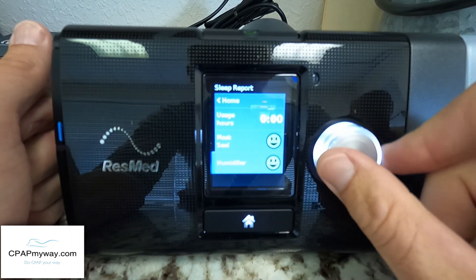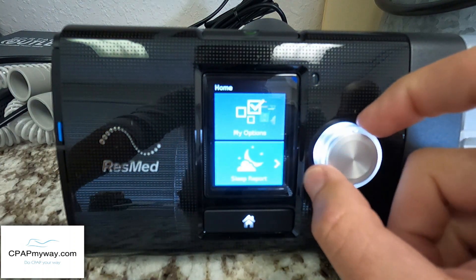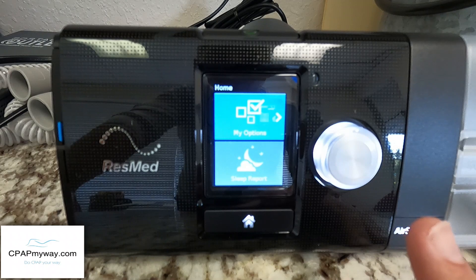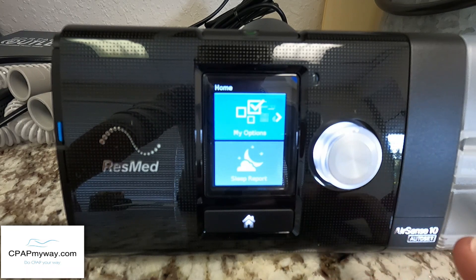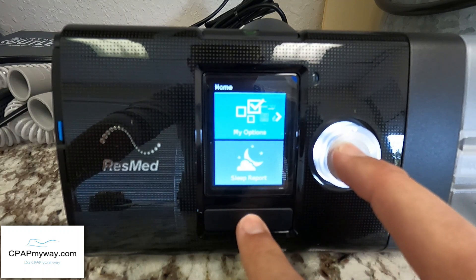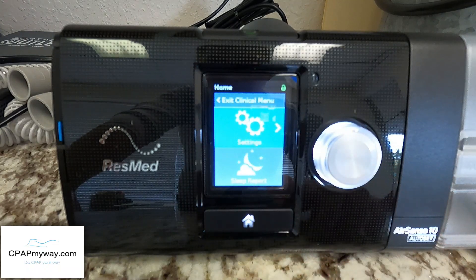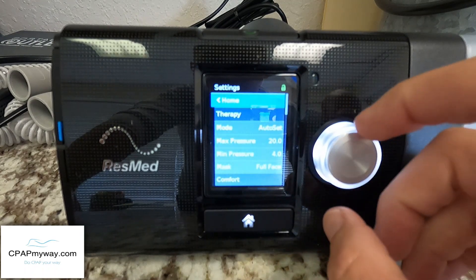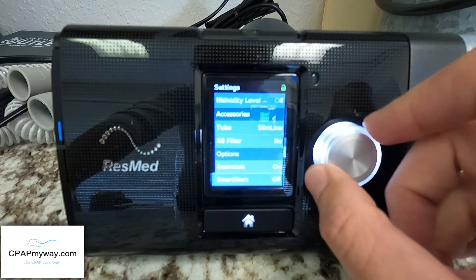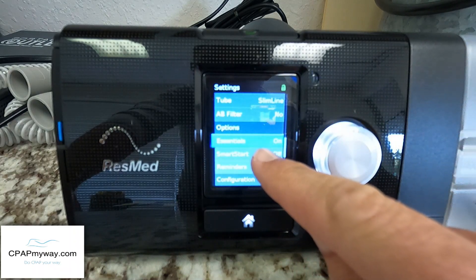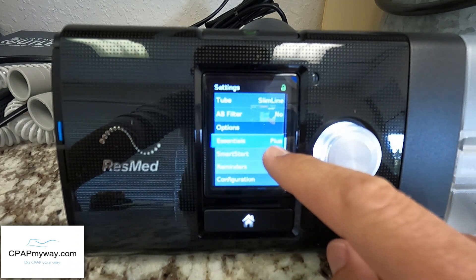On your device you have 'My Options' and 'Sleep Report' to toggle between — just twist the dial. If you twist it down and click on Sleep Report, you're going to see usage hours, mask seal, and humidifier. That's not the detailed view most people want. To enable more detail, I'll show you how to get into the provider menu. Press and hold the home button at the bottom and the toggle button to the right — you'll see it says 'Exit Clinical Menu,' which means you're in the provider menu. Click on Settings, scroll all the way down to Options, and you're going to see 'Essentials' — change that to 'Essentials Plus.'